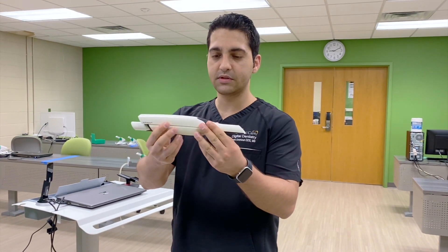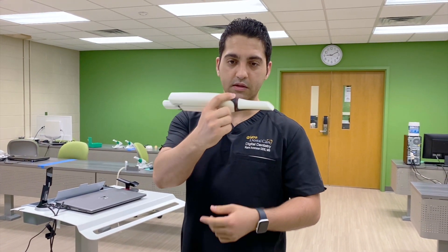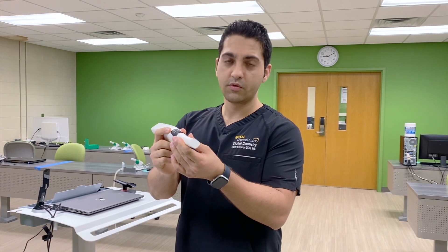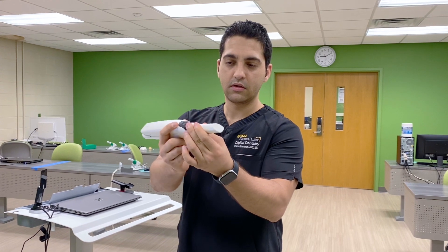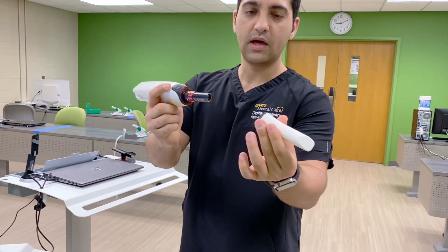The Trios 4 comes in a pen grip like this. And if you want to remove the tip, you have to twist it like this and pull it out.